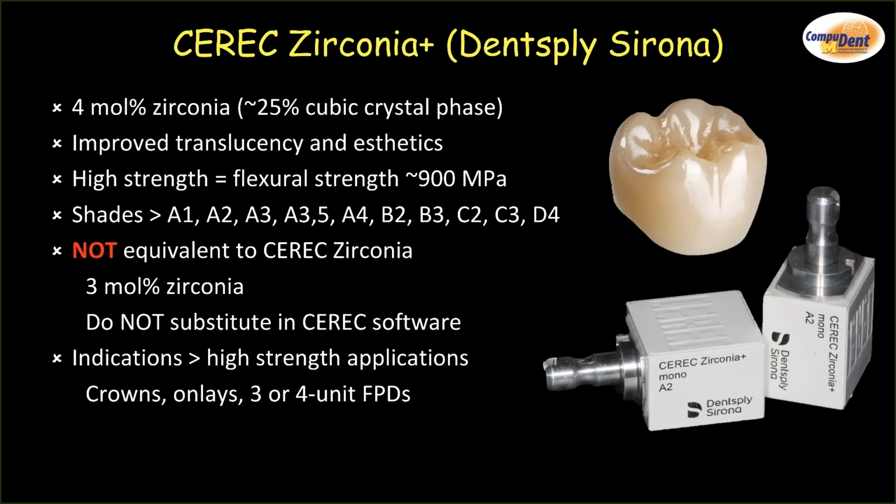The other newer zirconia that's been launched is CEREC Zirconia Plus, also by Dentsply. Dentsply would recommend this as your more strength load-bearing zirconia because it is a monolithic shade, not a multi-transitional layer as the other one was. It is not equivalent to CEREC Zirconia. Just for those of you who remember the CEREC Zirconia, it's not the same.